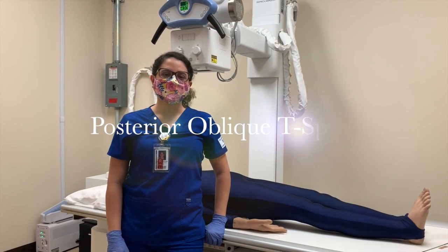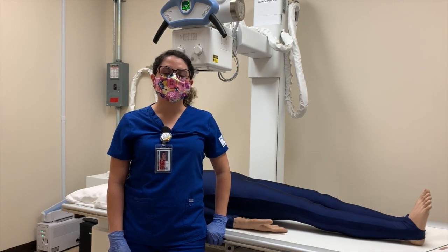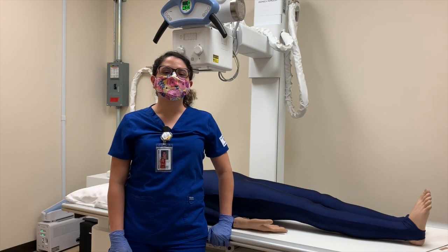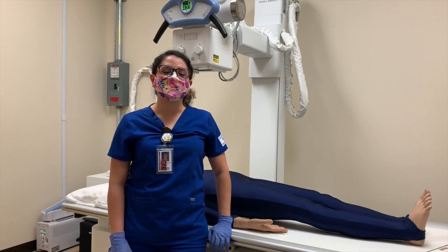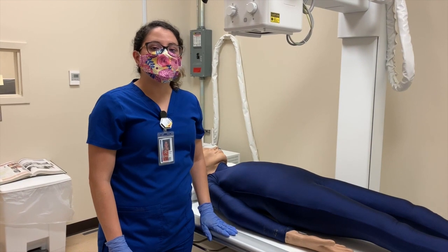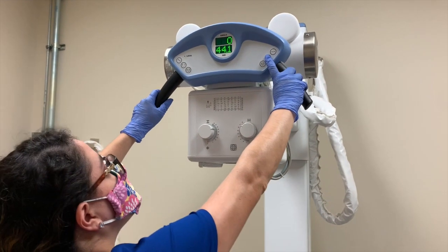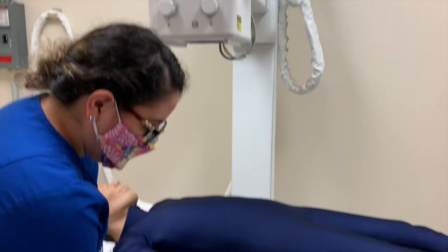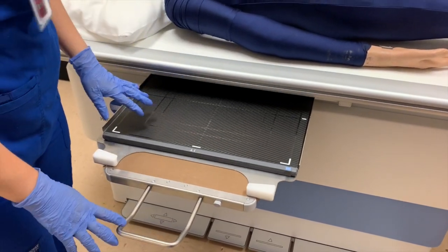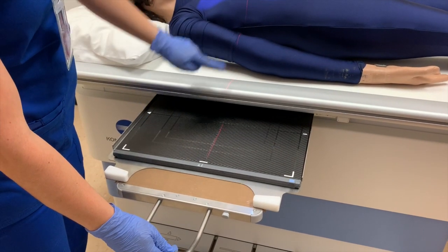My name's Camille Hernandez, and I'm going to be showing you how to do the right and left posterior obliques of the T-spine. Some of the pathological indications include pathology of the zygapophyseal joints and of the T-spine. Both right and left obliques are taken for comparison. So to start, we're going to position our tube at 40 inches from the table. And for our Bucky, since it's digital, it's already at a 14 by 17. And it's already aligned.